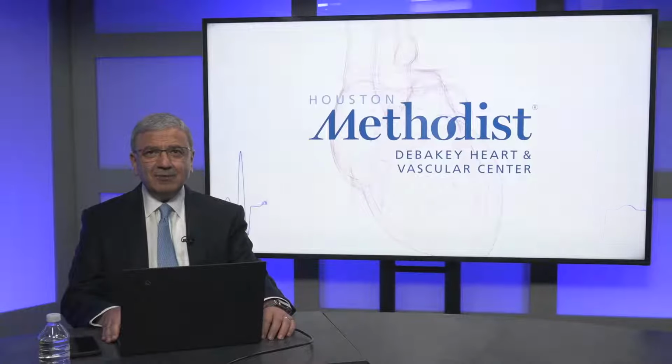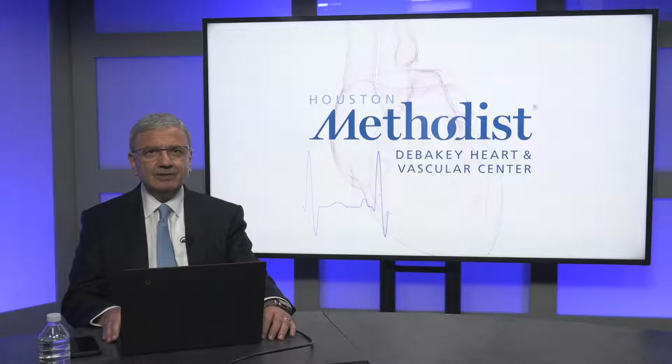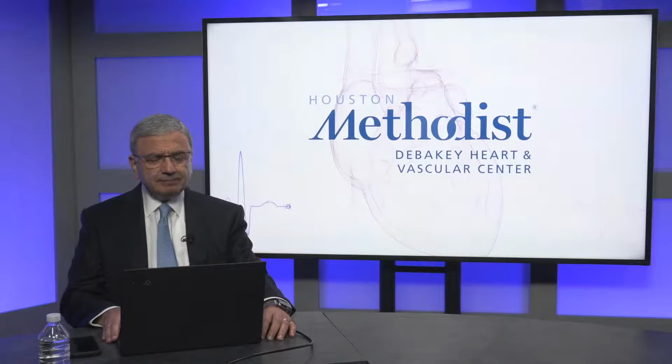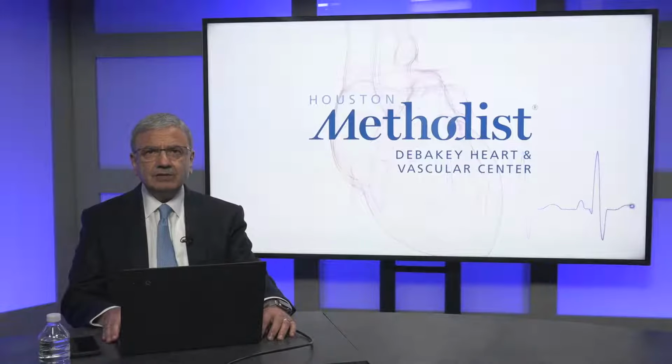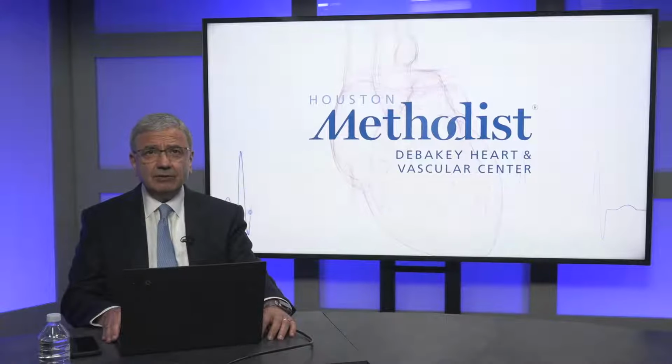And today I will be discussing a topic that is very dear to my heart and actually very exciting: over the years, seeing the field of echocardiography and contrast evolve, with its applications in cardiac ultrasound. So what we will discuss today is all these ultrasound enhancing agents and the technique that we will be using, the impact on diagnosis as well as clinical management. So let's go ahead and get started.